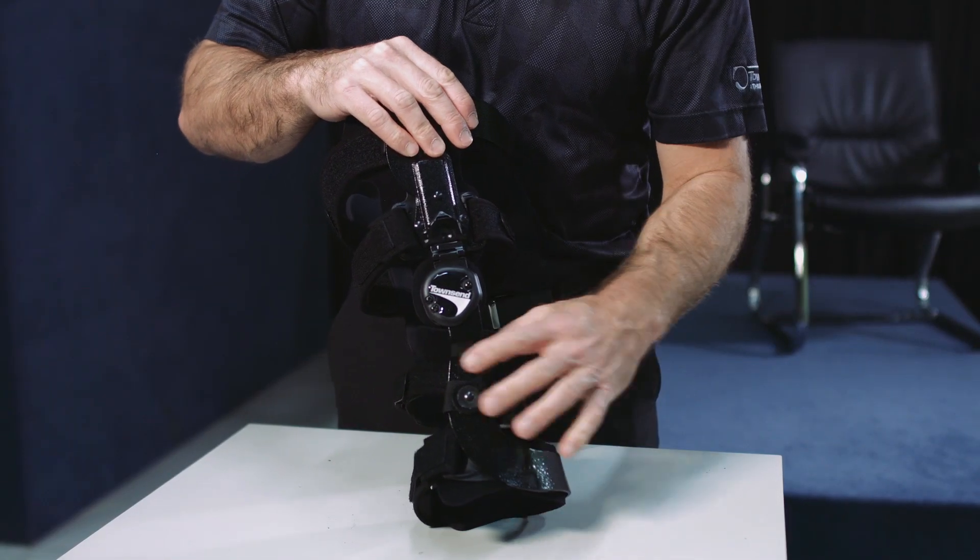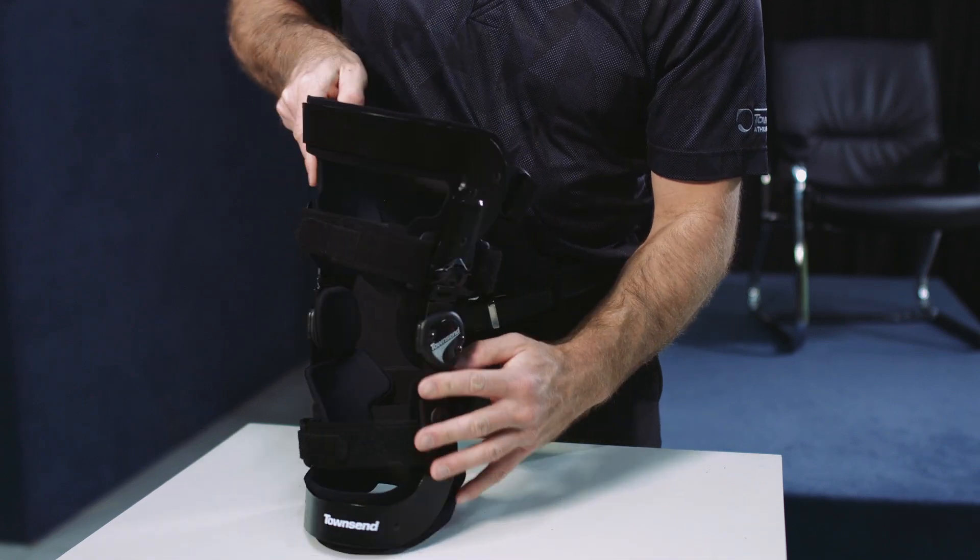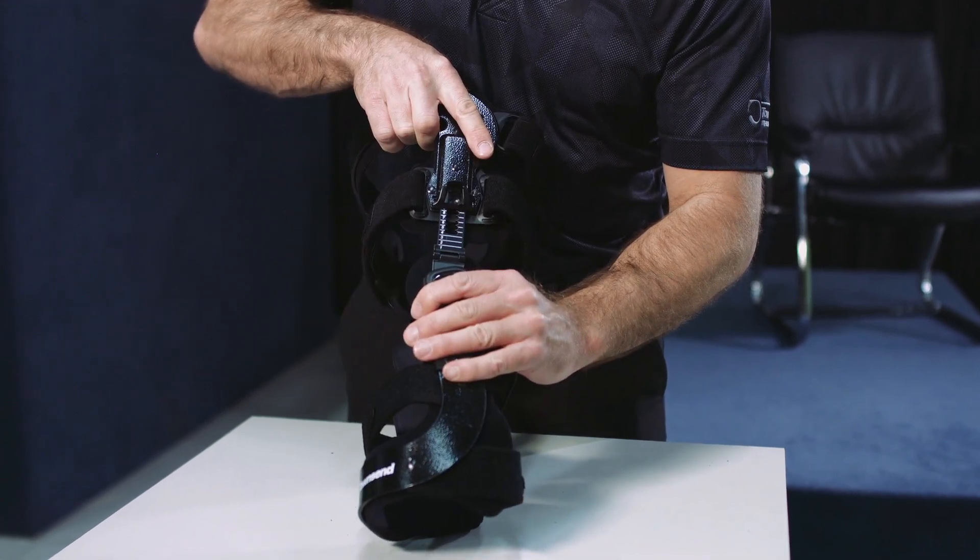The Rebel Reliever brace features Townsend Design's load shifter technology that can be used universally for unloading the medial or lateral compartment of the knee.